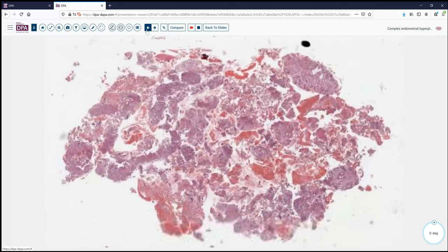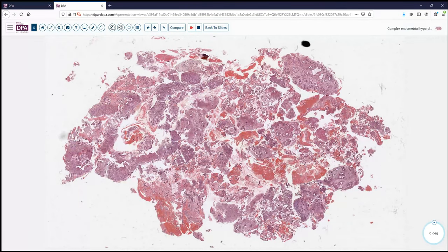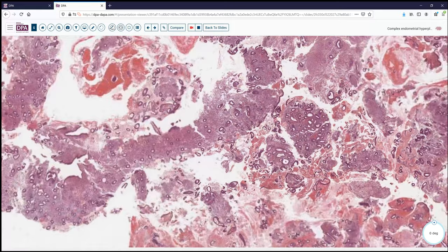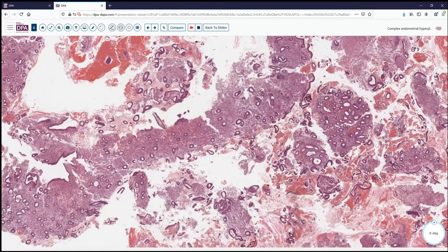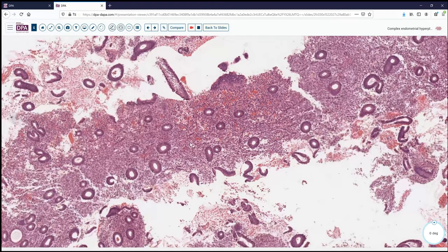Here's a case — curettings from a perimenopausal bleeding patient. Is this hyperplasia or not? As we can see, much of it doesn't seem to have an increased gland-to-stroma ratio. A lot of these areas show very benign, small, widely separated glands in a proliferative pattern with a fairly compact stroma. This doesn't look like hyperplasia — it's barely proliferative. What we do have is a fragment here that looks a little different, with a different stroma.